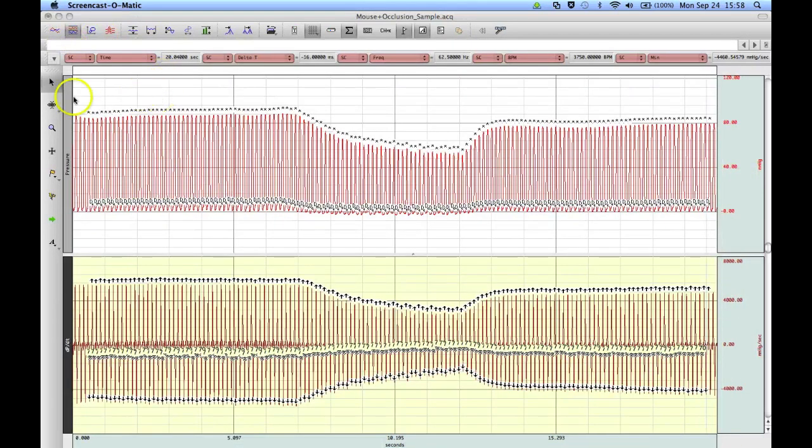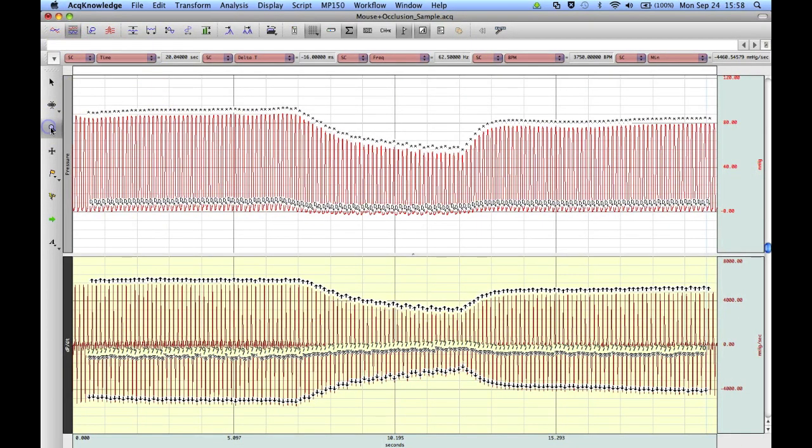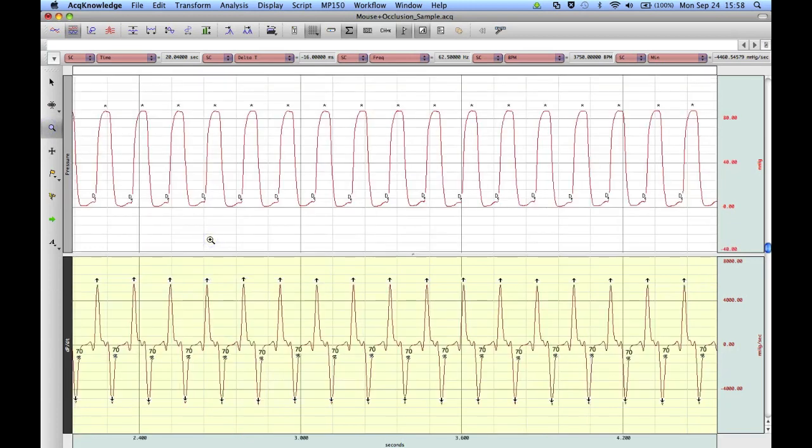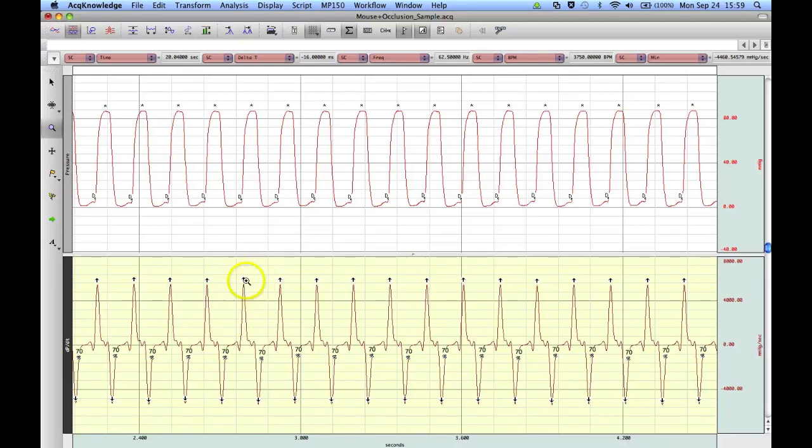If we go back into our raw file, use our magnifying glass, we can zoom in, and we can see the marks for the different points on the derivative. We've got DPDT max, DPDT min, and then there's our percent recovery.